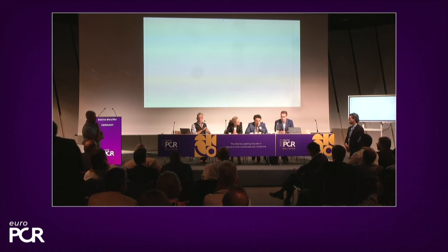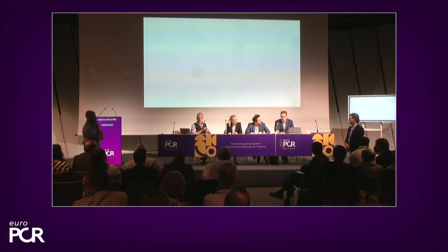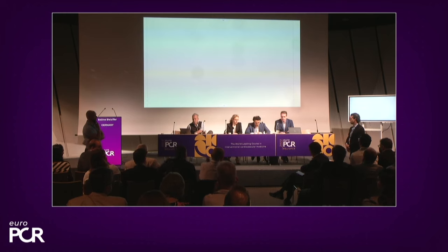Another thing to consider is what's the appropriate valve size. We don't have a consensus on that yet. There are different formulas you could apply. You could size according to the original native annulus. You could size upon the true ID, similar to surgical valves of the first valve. So we don't know yet.